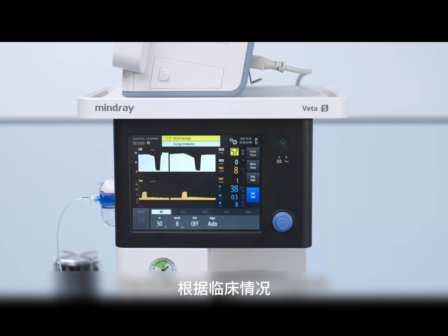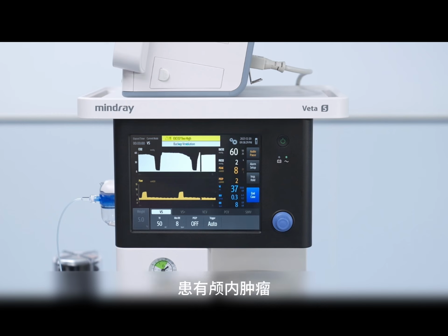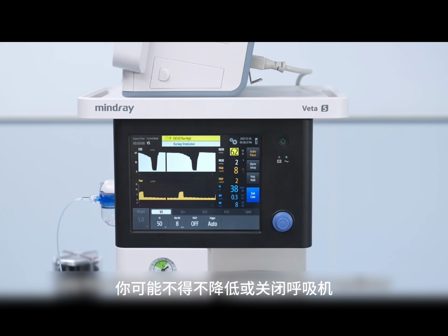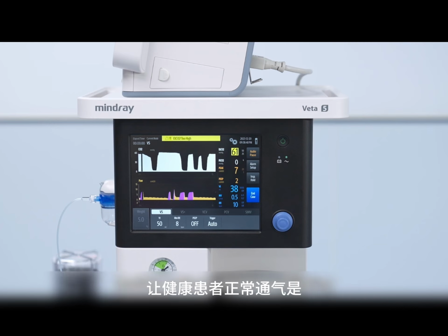Depending on the clinical scenario, you may decide to hyperventilate certain patients, such as those with an intracranial tumor and an elevated intracranial pressure. However, if your patient is hypotensive, you may have to downgrade or turn off your ventilator and permit a certain degree of hypercapnia. However, using mechanical ventilation to keep your healthy patients normoventilating is appropriate if the circulation is stable.